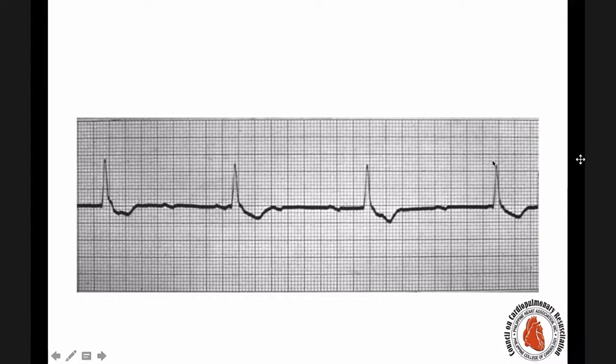So bradycardic yung ventricular rate, tachycardic or normal rate yung P wave, there is a complete dissociation. Okay? Mahirap siya at your level, but ang nakakatulong sa akin is if the PR interval in all beats are nag-iiba-iba. Ito PR interval niya parang ganyan siya. Ito sobrang haba. Ito naman sobrang narrow, shortened. Ito naman wala talaga.